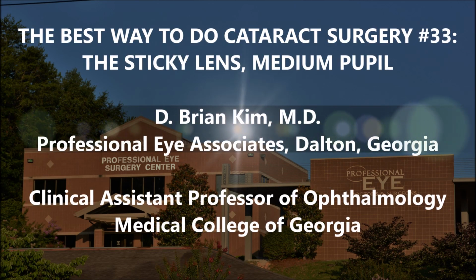I'm going to share with you case number 33 in the best way to do cataract surgery series. This is a medium pupil, moderate size lens, but more importantly, it's a sticky lens, a lens that as you begin to chop it and separate it, it tends to still be attached to the main piece of the cataract, and it's a little bit more cumbersome and annoying to do.